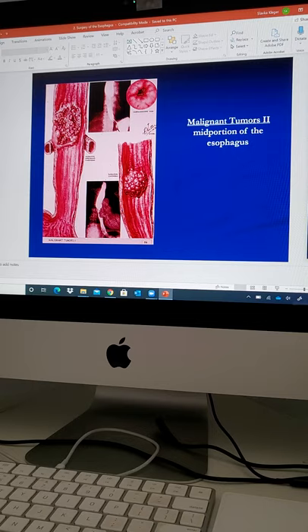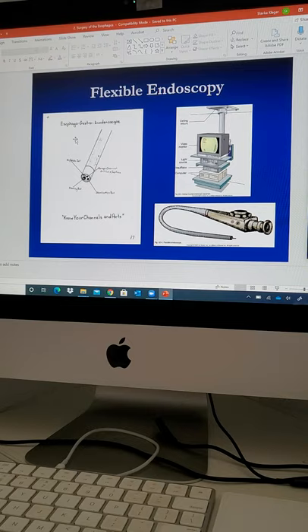All right, so what can affect the esophagus would be the strictures, varices, achalasia, diverticula, cancer, and atresia. When we want to diagnose these conditions, we're going to use the esophagoscope. Okay, so this is the EGD. I told you to look at the ports. You don't have to memorize exactly where the ports are located, but you have to know these four ports which are on the esophagoscope. This is the flexible one.